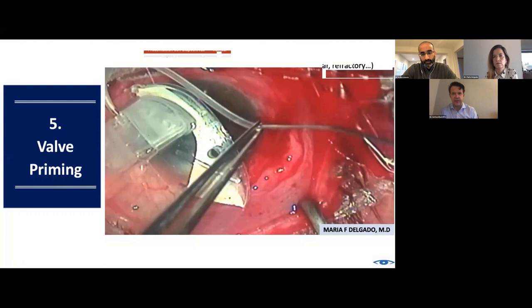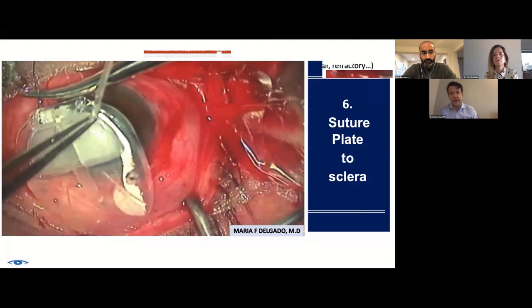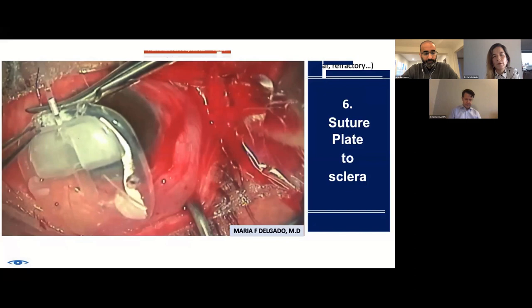That's right. And of course, viscoelastic is going to be coming through that thing after in most cases, and that doesn't seem to damage it or do anything either way. So I feel like it's a robust mechanism. And as long as you get some aqueous going through, you're good to go. Yeah, this is great, Maria. You're showing a lot of really good pearls here for people. So keep it going.